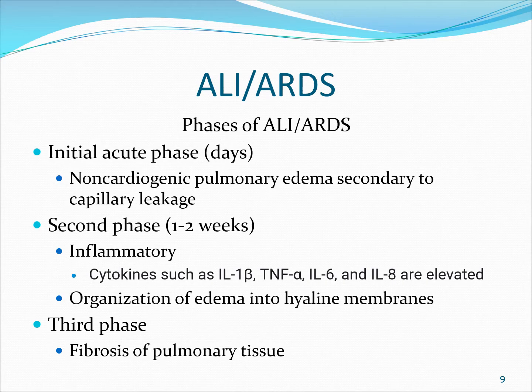Absolutely, this patient's going to be intubated. And when you put them on mechanical ventilation, you really want to use a good strategy with them. The ARDSnet strategy is a great tool. They did a lot of research like that, but APRV is a great tool for this particular phase. So if you suspect someone's going into ARDS and you recognize the signs, like pulmonary edema, no cardiac insult, inflammatory responses with cytokines being released in the body, and poor oxygenation, you want to jump and put the patient on APRV early.